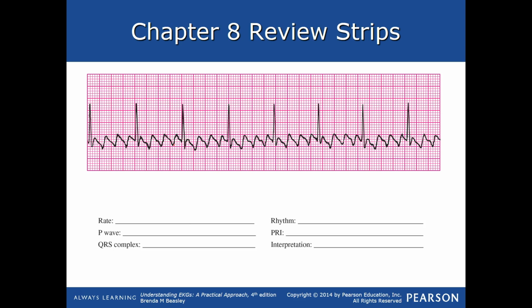If you would like to, that's okay. You're more than welcome to. The one thing I'll ask you to do though is to make sure that you're right. I always say don't get into something that you don't want to get into. So if you say that is a 4-to-1 ratio and it's really a 2-to-1, that's going to be wrong. So this is atrial flutter, or it's atrial flutter with a 4-to-1 ratio.